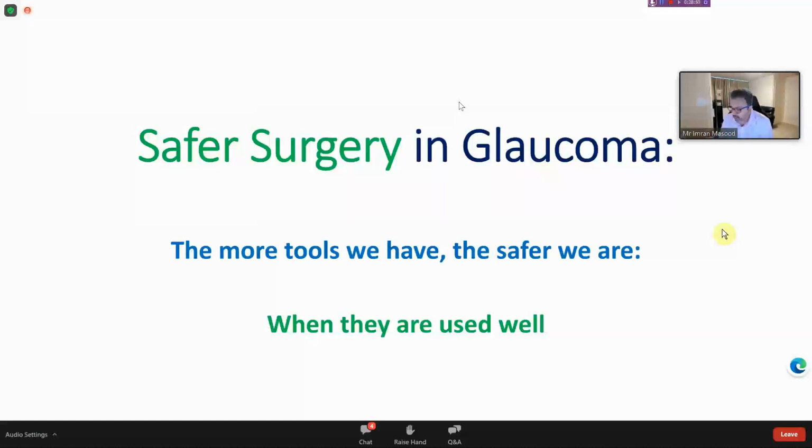And there was a little bit of blood in the eye as well, because I actually had to do a very small surgical iridectomy where it just kept coming out, and I had to get the side closed. And then remarkably, immediately post-op, so I saw him about 2 to 3 hours post-op just to check, his pressure was about 15, and the next day it was 12. I mean, I'd given him one tablet of Diamox.